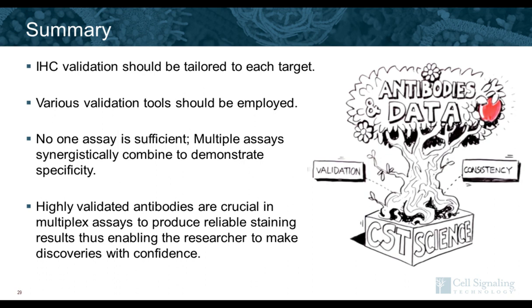Okay, and Bill, let's stick with you. Can you please clarify the specific protocol differences between hand staining and automated staining using your platform? Yeah, so obviously it's a little bit different putting slides on the Bond or the Discovery Ultra. The main differences being the heating steps.